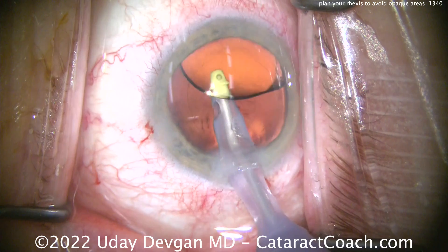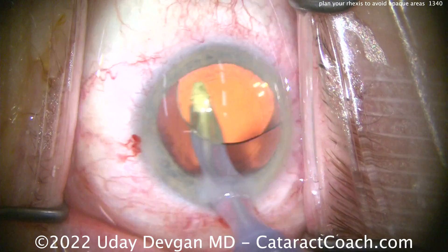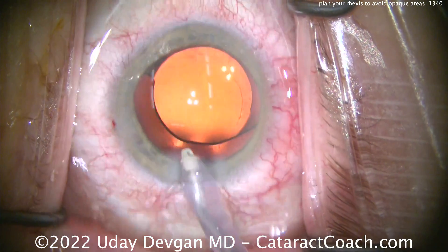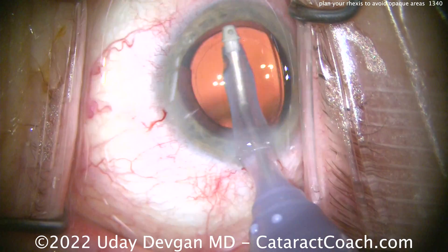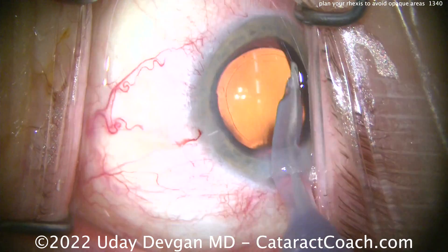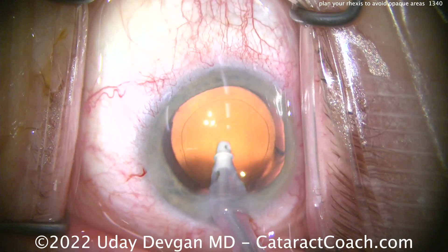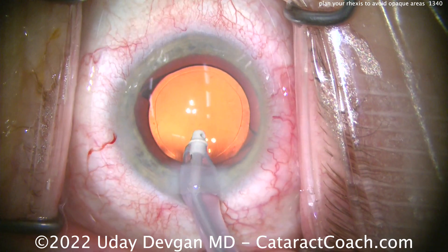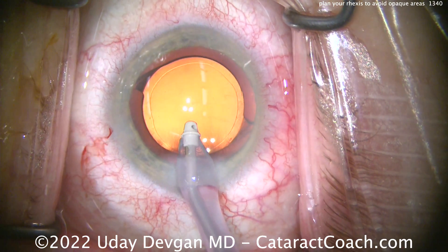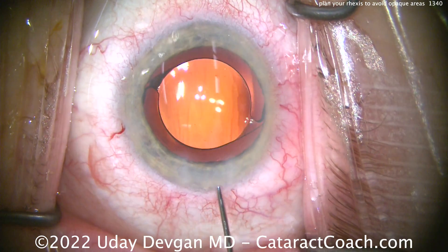Try this technique — I think you'll find it very useful. You can use the previous video, number 1339, which is about using the cannula to milk or push some of that liquefied lens material to get those cortical spokes out of the path of your capsulorrhexis. But in a case like this, there are a lot more cortical opacities, and some of them weren't necessarily purely liquid — some had become a little more fibrotic in nature, which made it a little more difficult to move them out of the way.